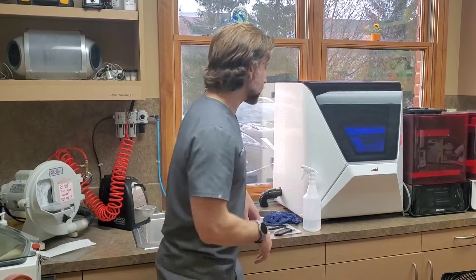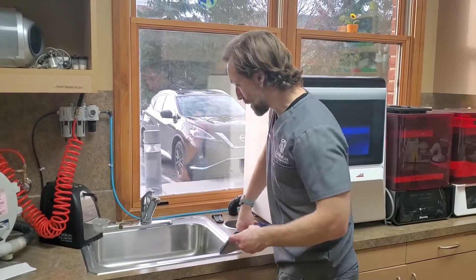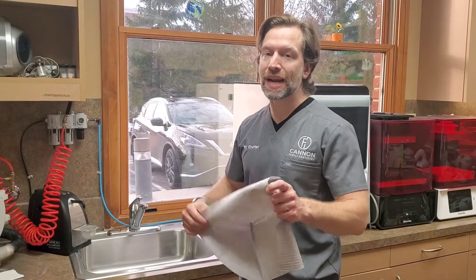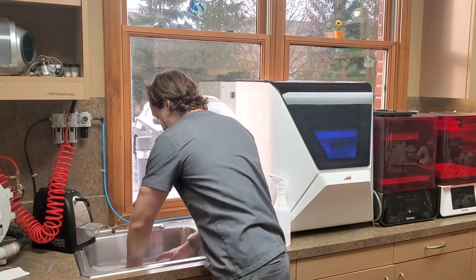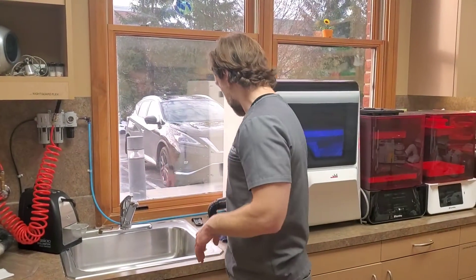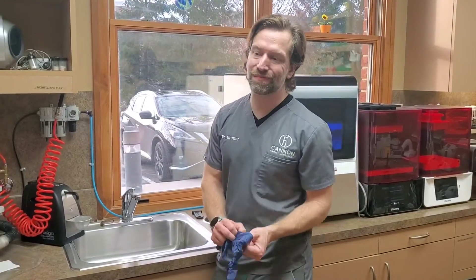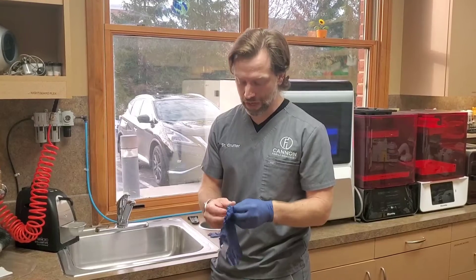Let's go ahead and set this up. The reason I have the patient bib is I actually put it in the sink because we're going to be spraying a lot of alcohol and resin getting it off. I don't want to just throw it on the drain, so I place it right in there so that when I'm spraying, it hopefully collects mostly in there. I have two pairs of gloves because the first thing I'm going to do is remove the print and supports — it's going to get kind of nasty.